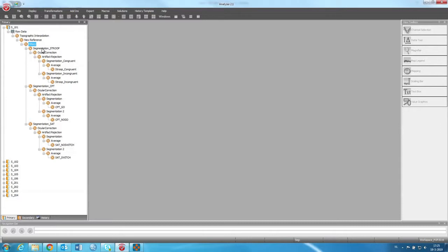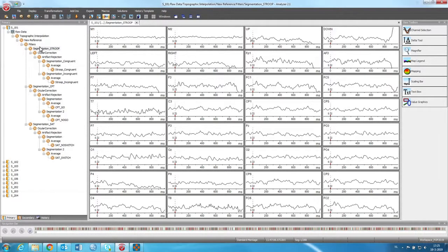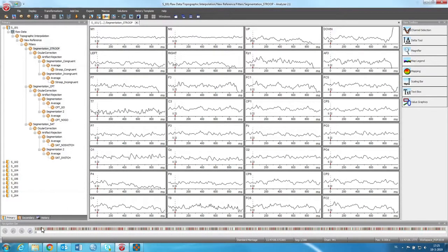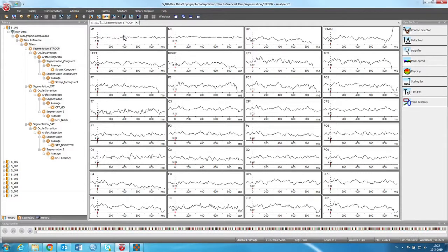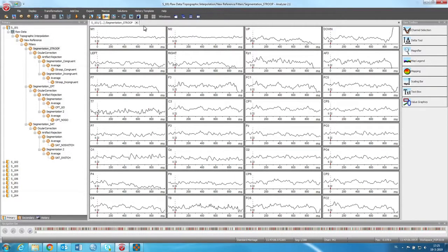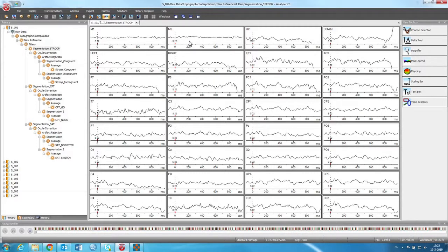The first next step is segmentation. What we do in segmentation is for every trial in the data that we select, we want to have a segment, or sometimes people call this a trial or an epoch. This is the continuous data that is cut around a certain trial or stimulus.